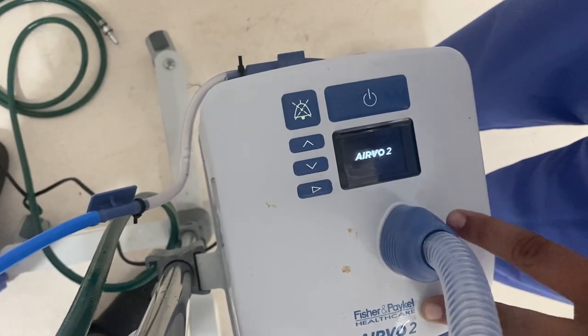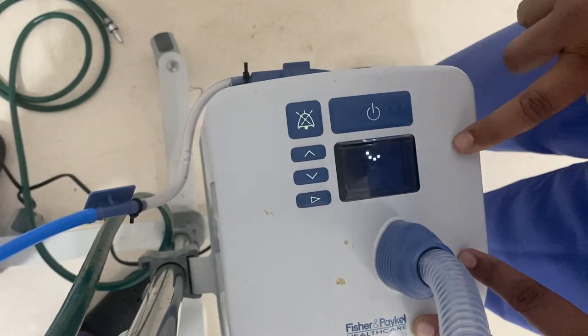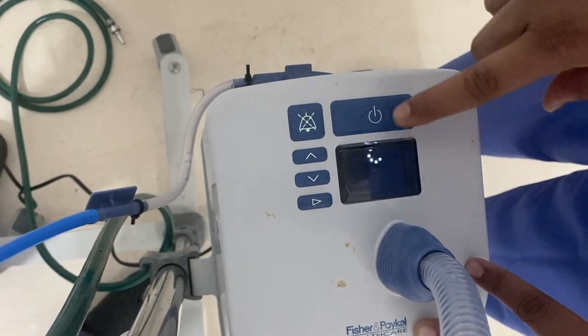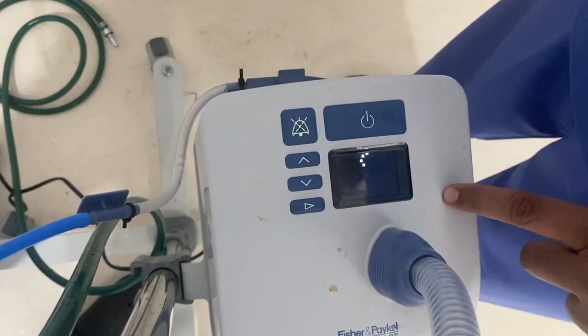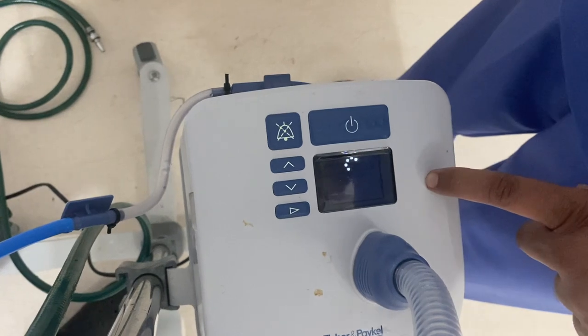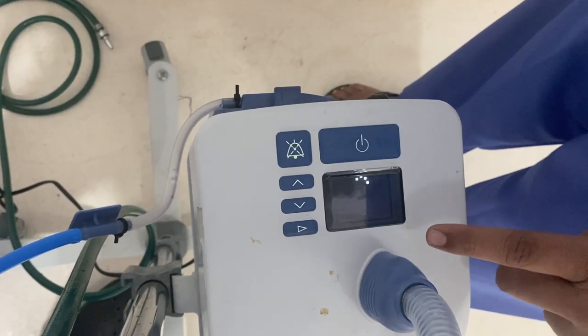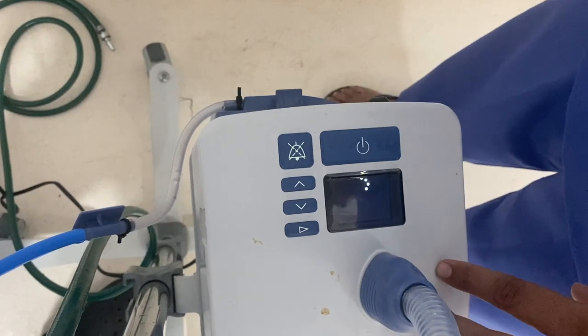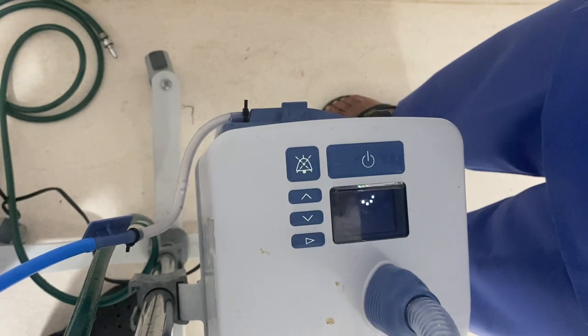So this is the machine starting up. Here the disinfection status is shown. We should not operate this machine if the orange light is displayed — that means the machine has not been disinfected properly.